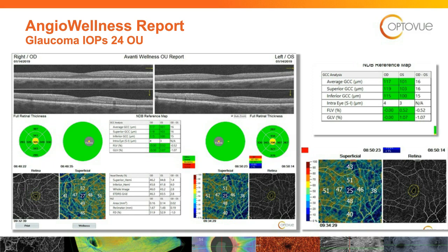That's where the ganglion cell complex sits. So this one here flagged me that I need to follow this patient a little bit closer. And it's with the angio, and you can look right above it, the GCC is not being flagged. So we might be catching the earliest signs of glaucoma with this patient based upon that 40 sitting down there and that vessel density. And you can kind of see how it's forming how an arcuate would form.